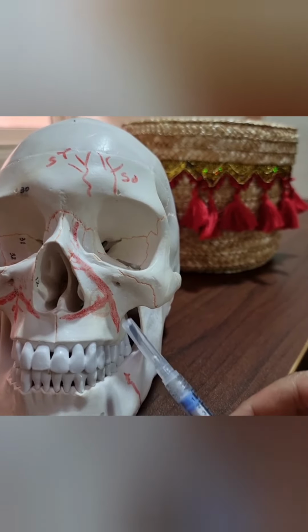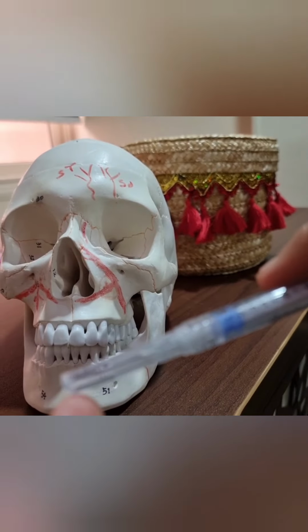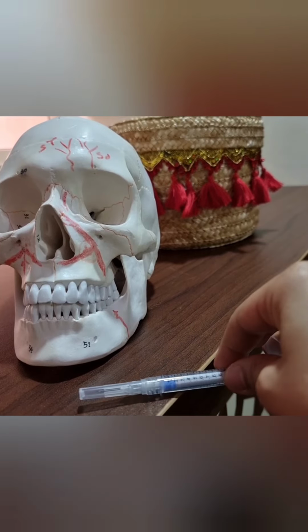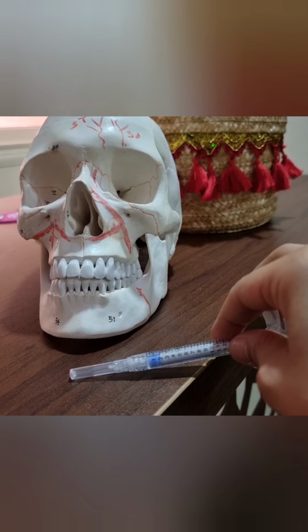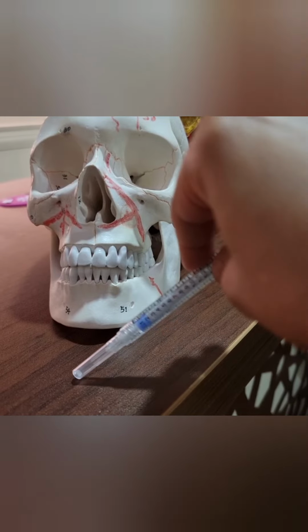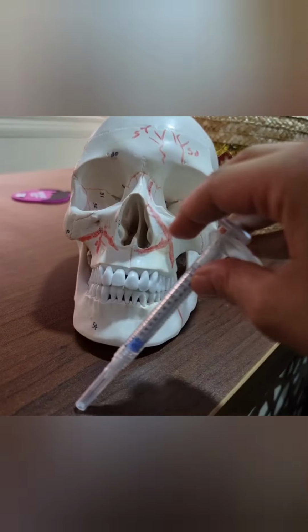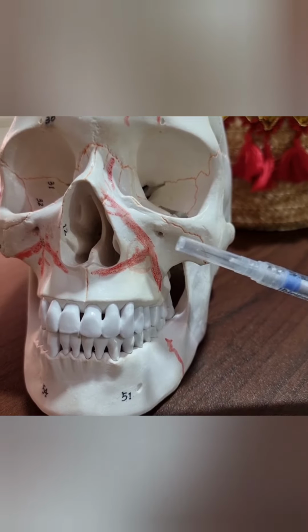When I go from down, الزاوية ما بين النيدل and the skin, this is called the angle of injection. Sometimes when it is 10 to 20 degrees like that, it is superficial. When it goes to 30 degrees it may be also subdermal or subcutaneous. When I go 45 or 60 degrees I'm now subcutaneous, and also when I go 90 degrees now I'm deep on bone.